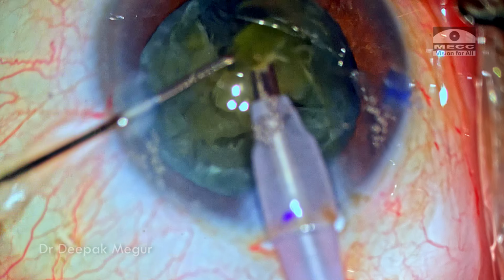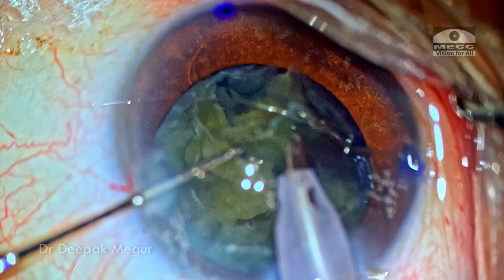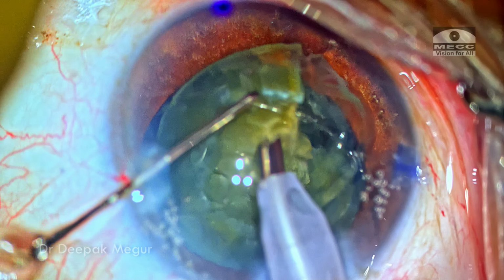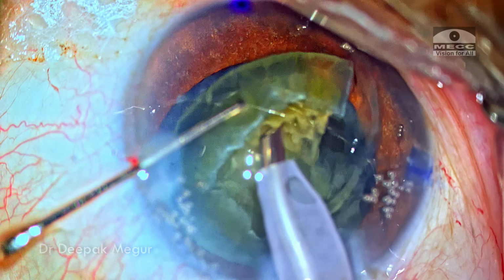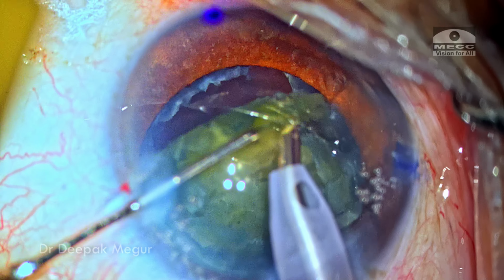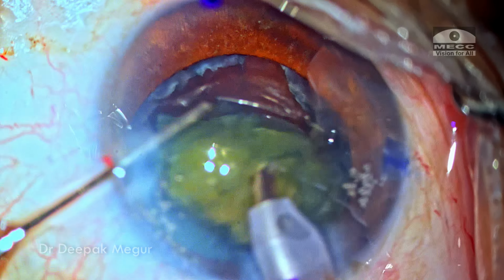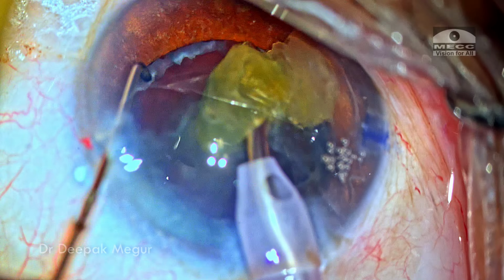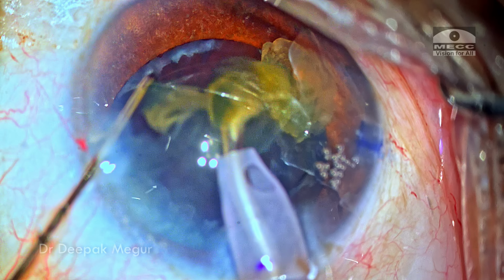And the emulsification of the fragments is begun. Now, since the rhexis is slightly bigger, the nuclear fragments are popped out of the bag into the antechamber, and they're quickly emulsified. The second heminucleus is also pulled out of the bag and emulsified quickly enough. The nucleus was not so dense, and managing the nucleus was relatively easy.